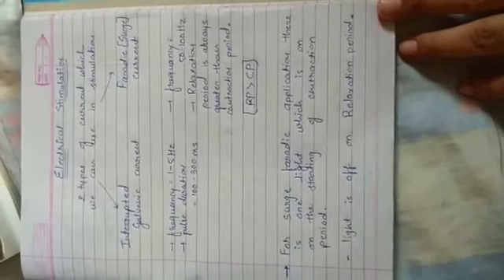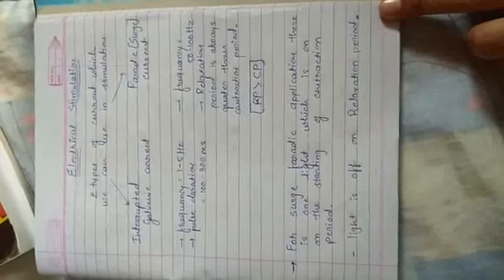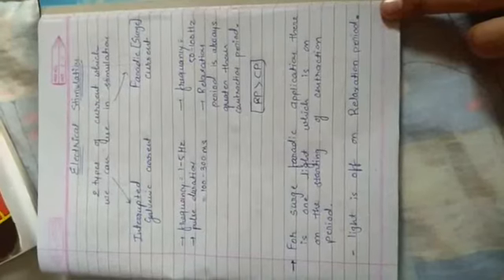For the application of the surge Faradic current, in the machine there is one light which shows the contraction period and the relaxation period. The light is on when the contraction period starts and the light is off when the relaxation period starts.